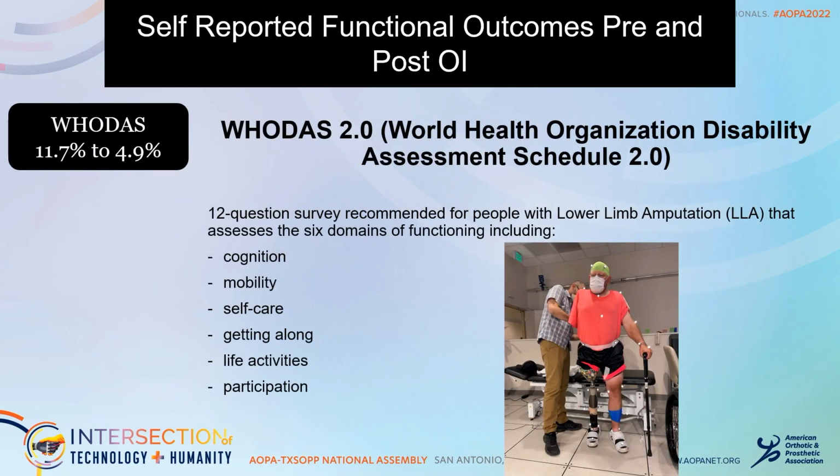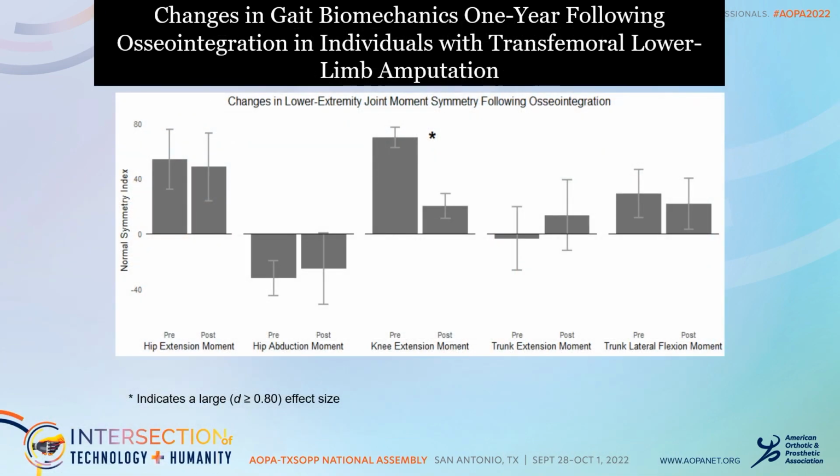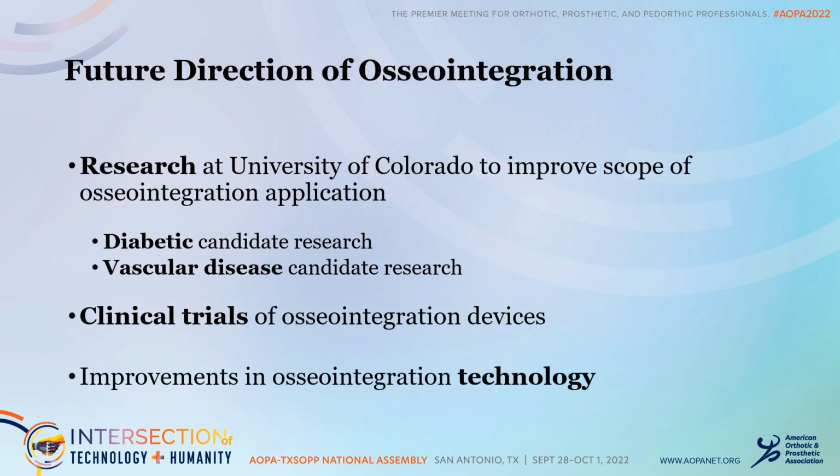How disabled patients feel improves significantly. Our gait biomechanics improve. We have these patients develop a more symmetric gait. They return to normal.